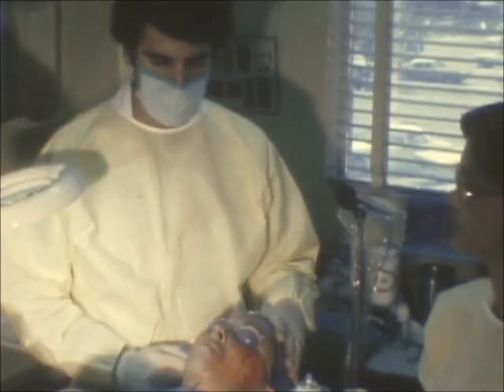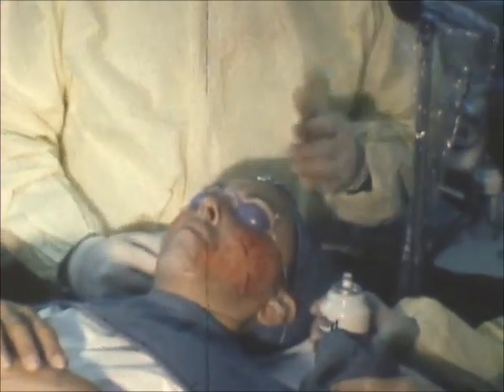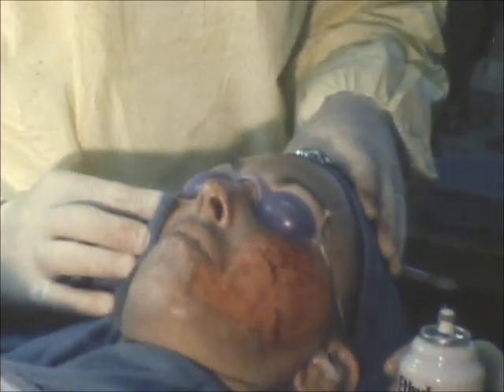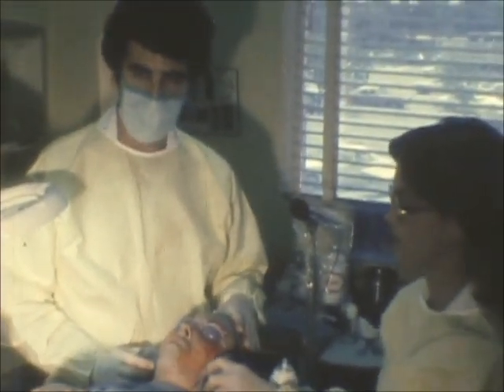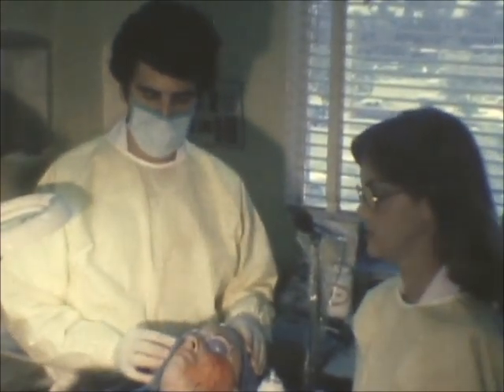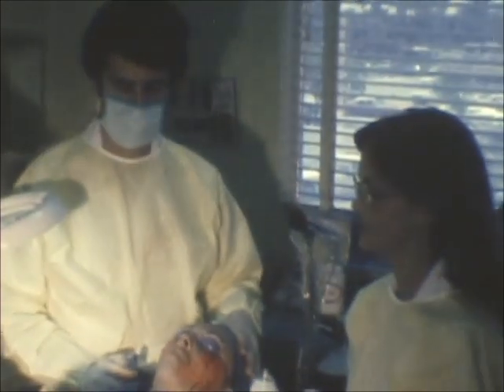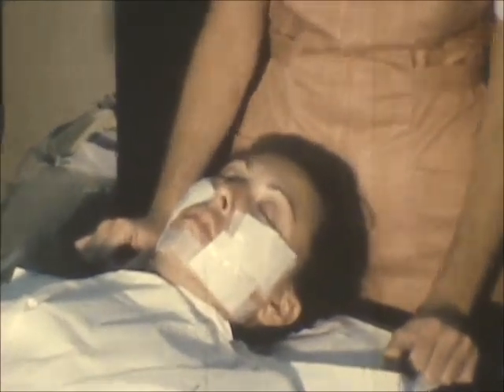At this time the dermabrasion is complete. The patient's face will be covered with a bandage overnight, then the bandage will be removed. The face will continue to ooze a clear yellow fluid, which eventually will stop. The patient will then compress the area in a few days with warm water soaks and apply a soothing ointment to prevent any crusting. This aids also in healing. Repigmentation can usually be expected within three to four weeks. What you see here is the finished product and the bandage can be removed 24 hours from now.